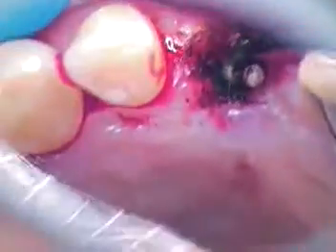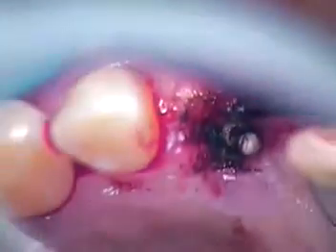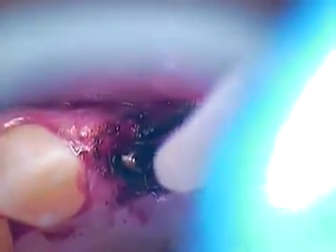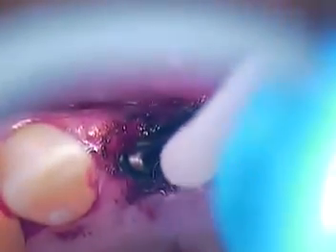Hello, this is Dr. Jerry Cuomo again. We're with the rescue case on tooth number 9. It's a Zimmer, I should say an old Corvent. We do have the screw now apparent out of the osseous site.